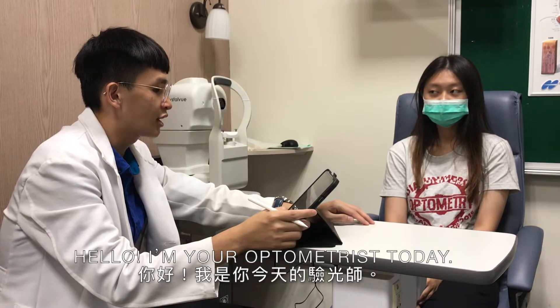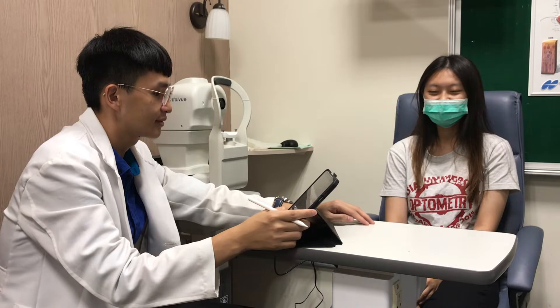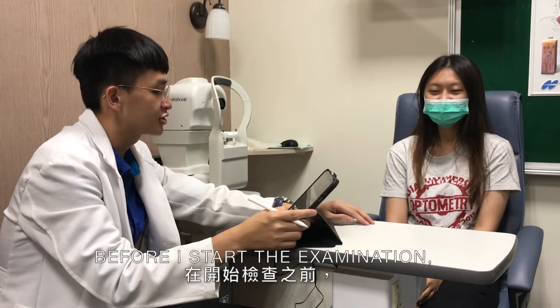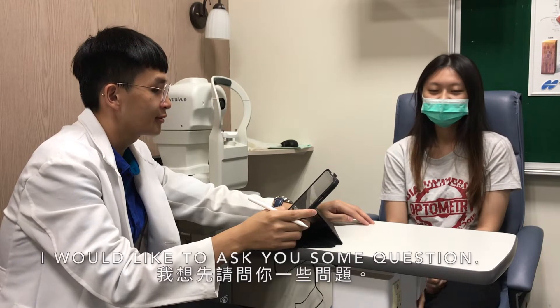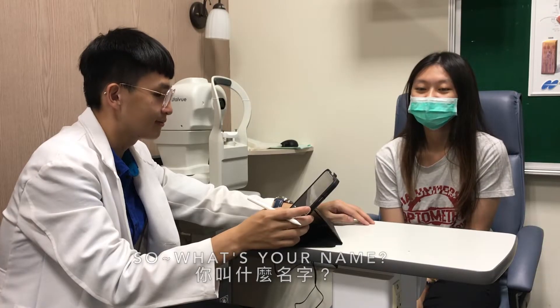Hello, I'm your optometrist today. Hello. Before I start the examination, I would like to ask you some questions. What's your name?